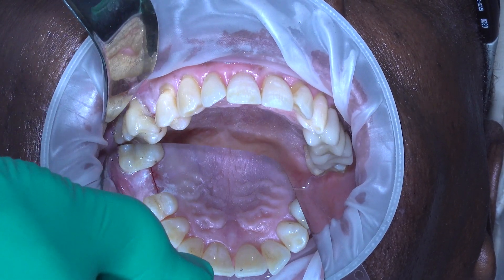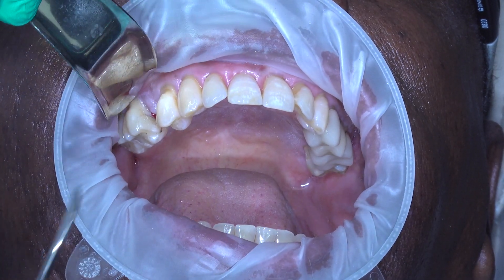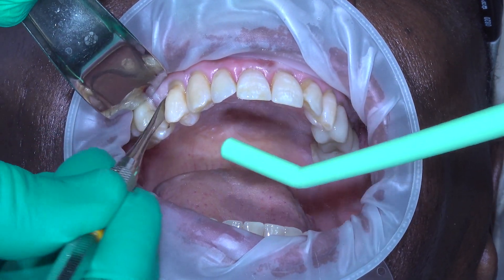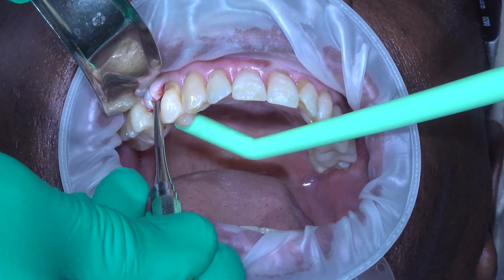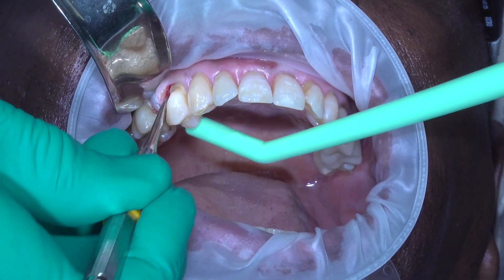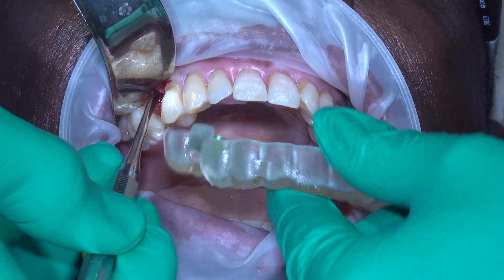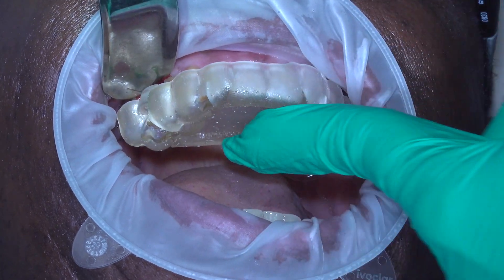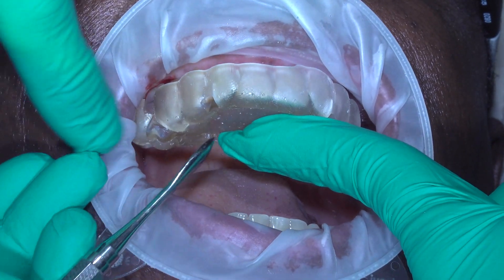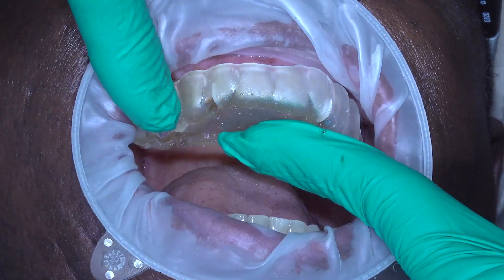What you can see here in the mirror is a beautifully placed crestal incision, lingually displaced, somewhat to the lingual. Then we use a MOLT9 to elevate the facial flap, but not the palatal flap — leave the palatal flap alone. Holding it back out of the way with the Minnesota, the surgical guide is seated. We verify by looking in the access windows that we are seated properly, and there's no gap, so we're confident that we can proceed.